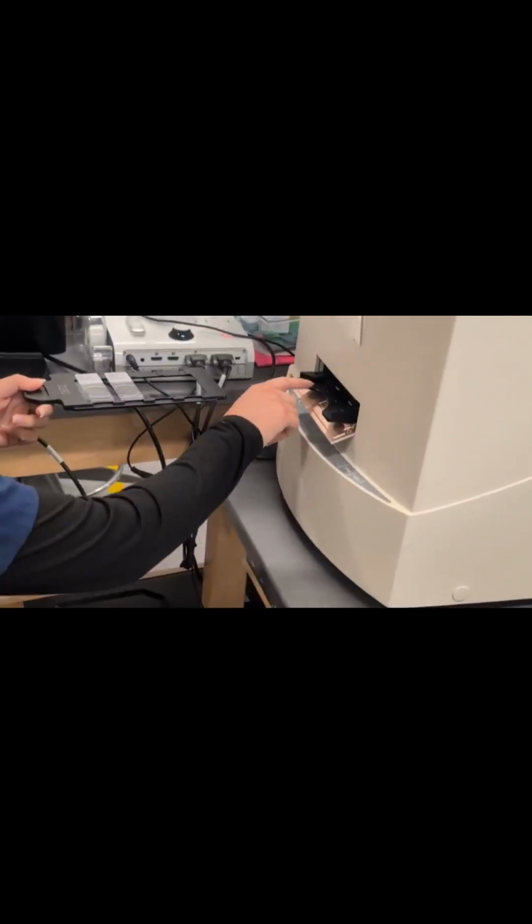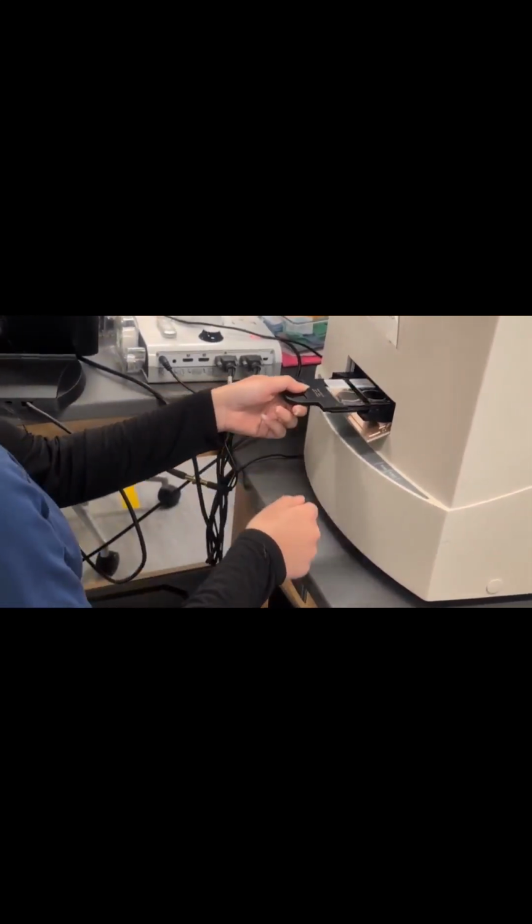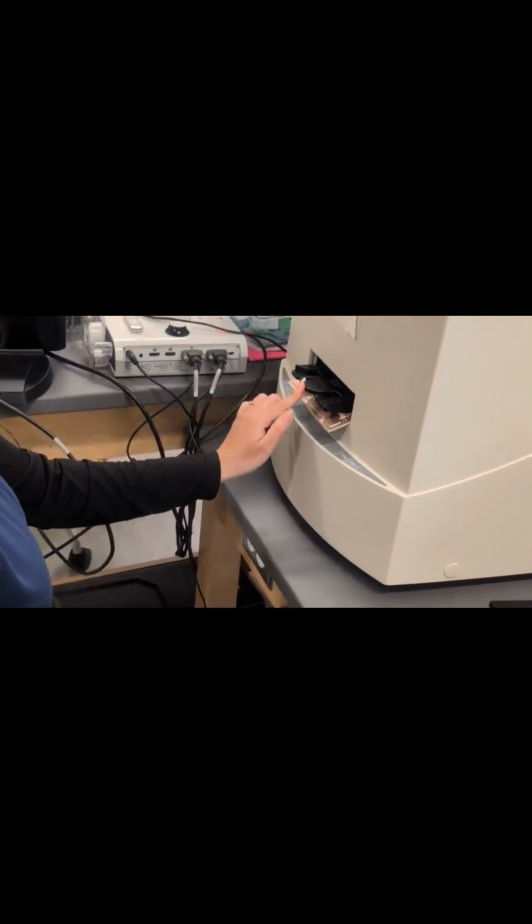When it pops up this message, you'll just hit OK, eject/insert, and then there's always a second tray out here, so I'll always just put my slides on the second tray, and then I can switch. So you're gonna grab from the handle right here, place it in between where these little lines are, and you're gonna push until you hear a click.